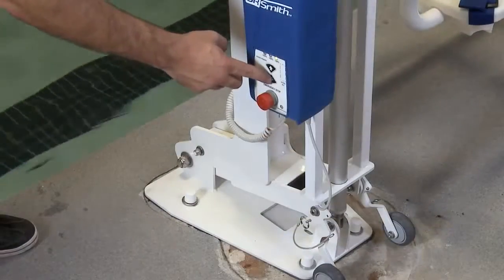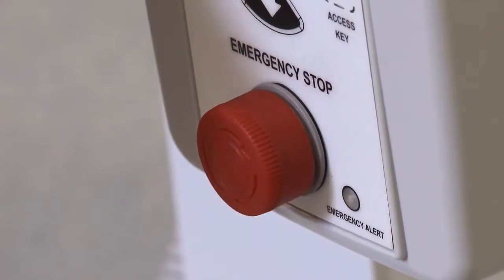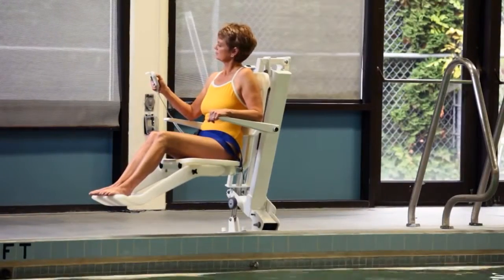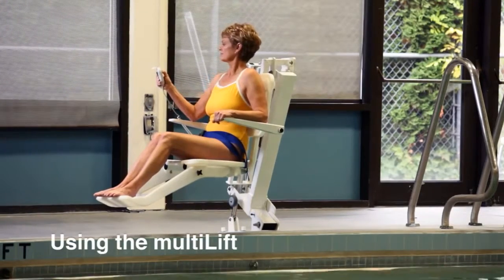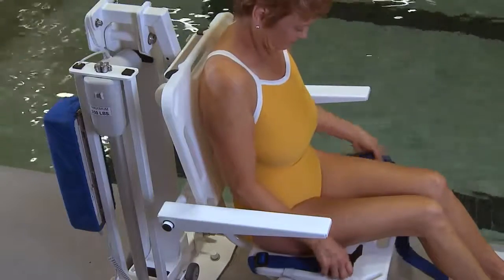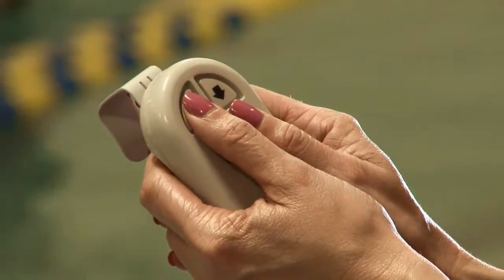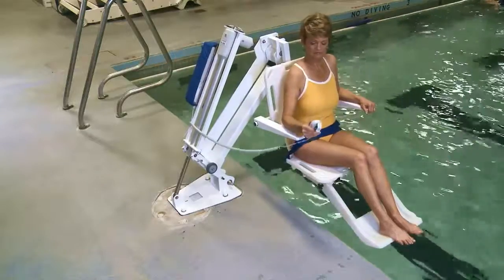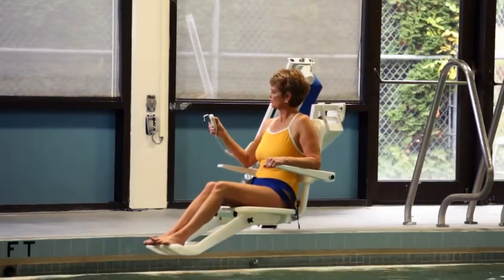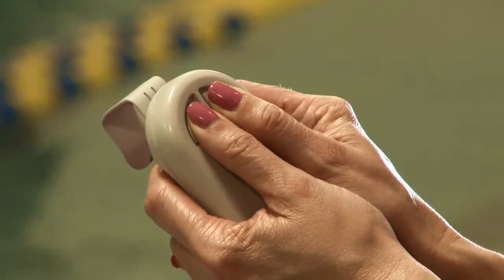The multi-lift is now ready to be tested. Check all controls and the emergency stop button to ensure proper operation. After the user has transferred to the lift, the user puts on the seat belt before using the hand control to lower the seat into the pool. The multi-lift is designed to enable a user to access the pool without assistance. If the user requires assistance while in the pool, they can activate an audible alarm by pressing two buttons on the hand control.